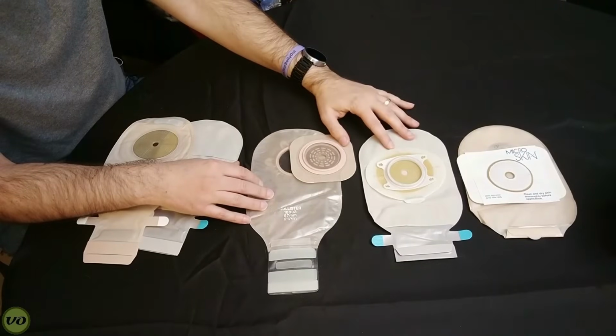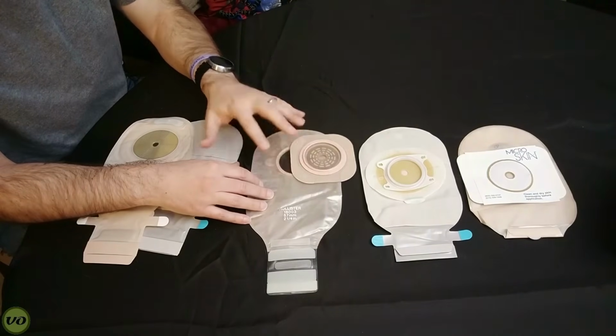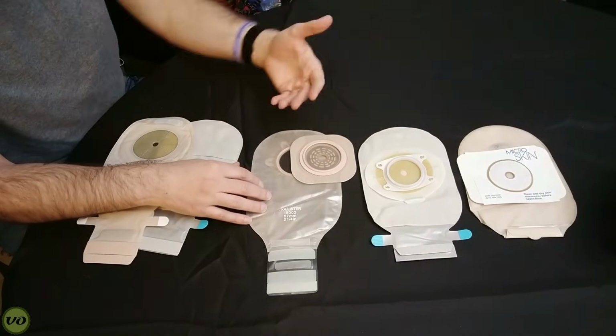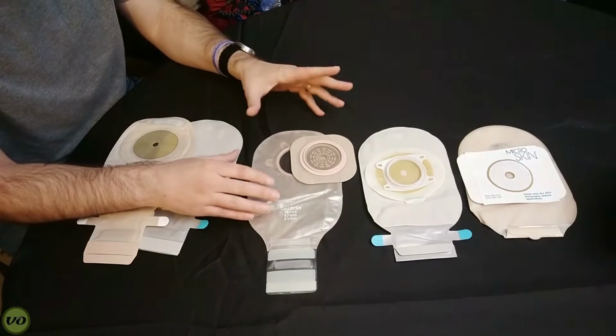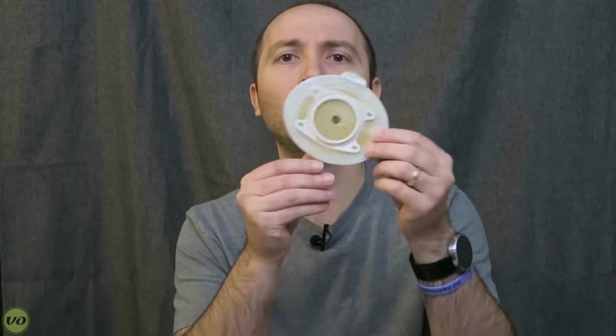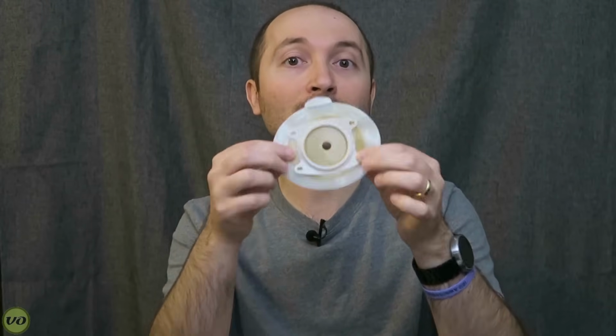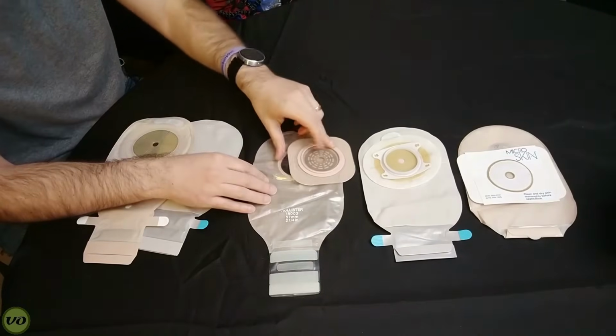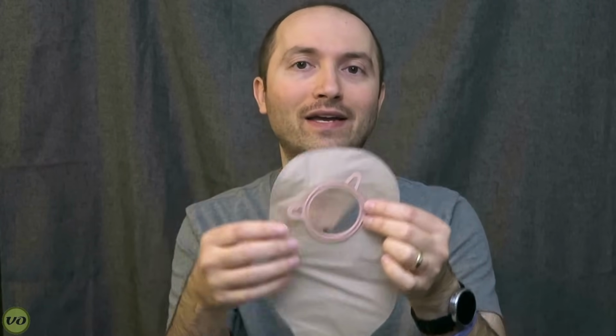So as you can see here, I've got a couple of examples of two-piece systems. One of them here is from Hollister, and the other one is from Coloplast. Now, from looking at the wafers, they seem to look pretty similar. There aren't too many differences. You can see here on the Coloplast wafer, belt tabs are actually on the wafer part rather than the bag, which is pretty unique, but I'll explain why. And on Hollister's, it's a very simplistic design, very minimalist. All you have is the flange there, and the belt tabs are actually going to be on the back of the bag. Now, why do both manufacturers do that?